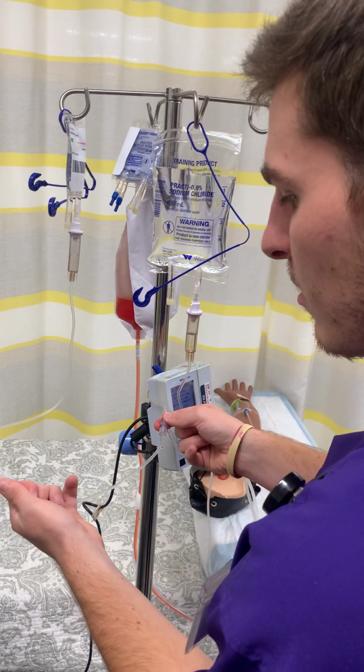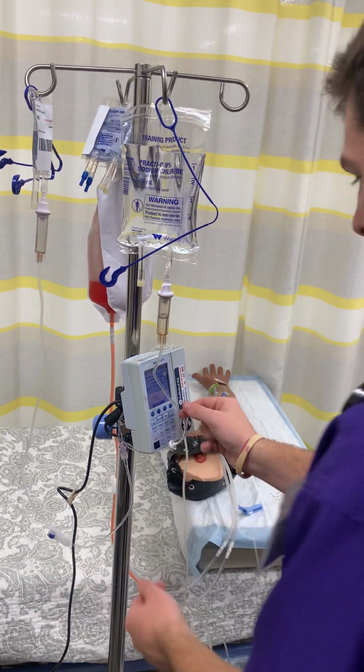Oh, good. Now we're opening this. Now we can push start.